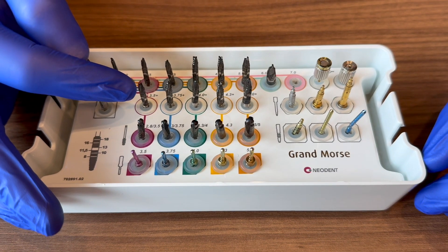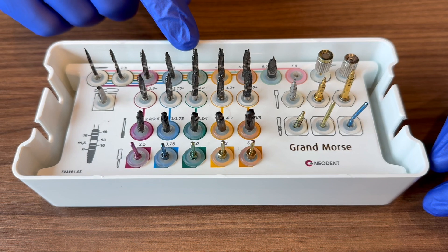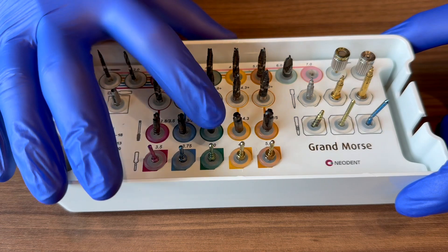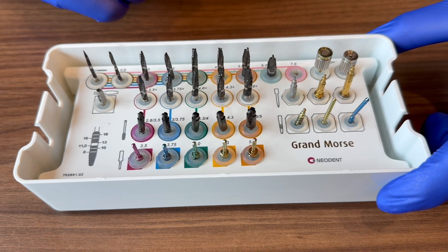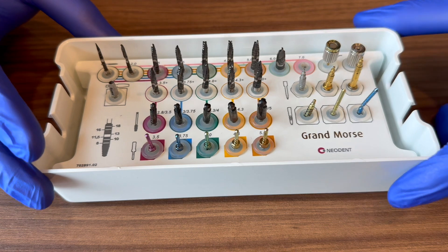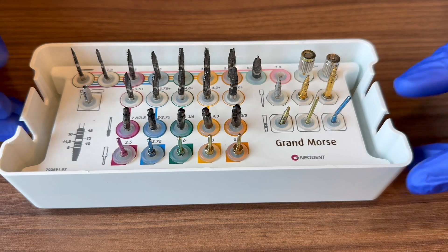There are additional drills for special situations. In extremely dense bone when placing a 4 by 10, you may want the 4-plus drill — it's slightly larger than the 4.0 and widens the osteotomy a bit. If you have ultra-dense bone with a cortical plate at the crest, use the profile drill at the bottom to remove some cortical bone so the implant doesn't get jammed on the way in.